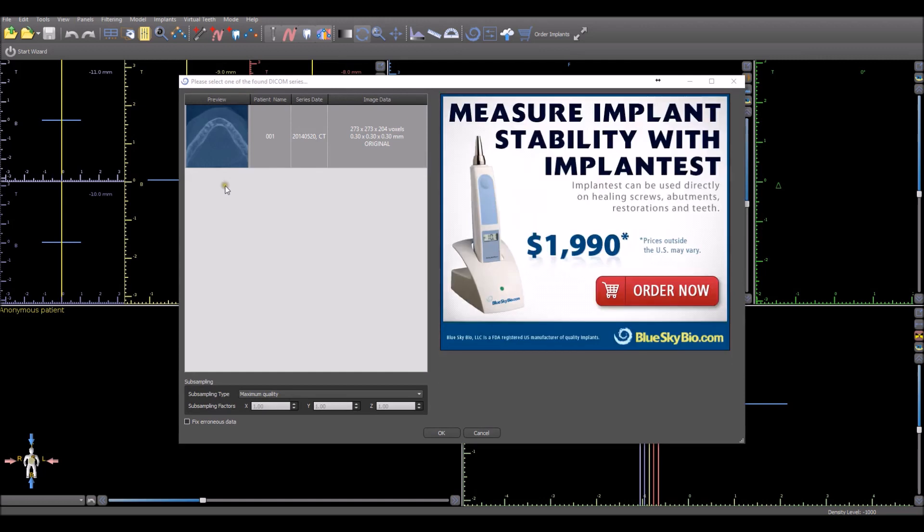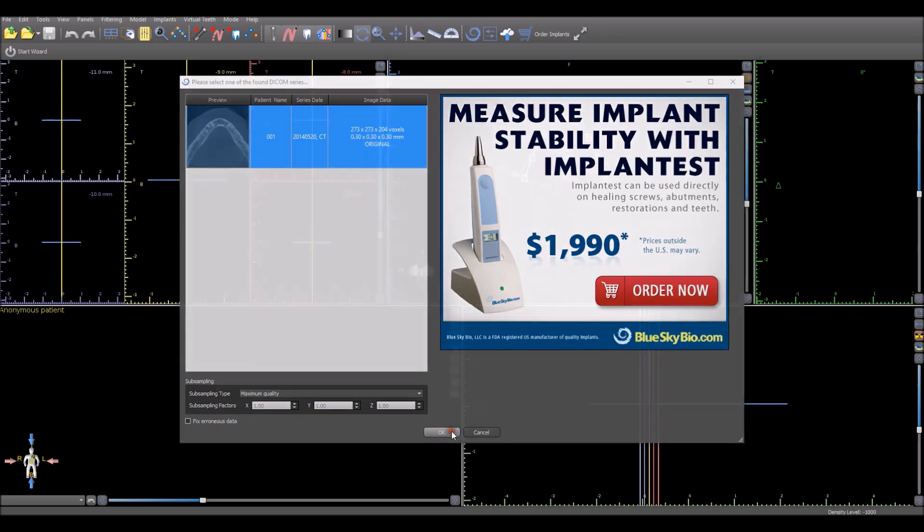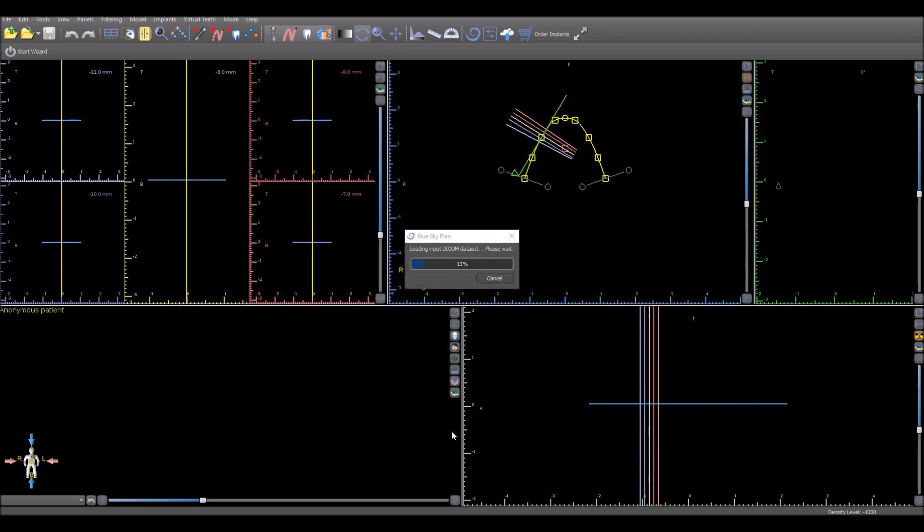What appears on the screen is any DICOM series that it finds will show up horizontally. Select the one that you want to choose, press OK.